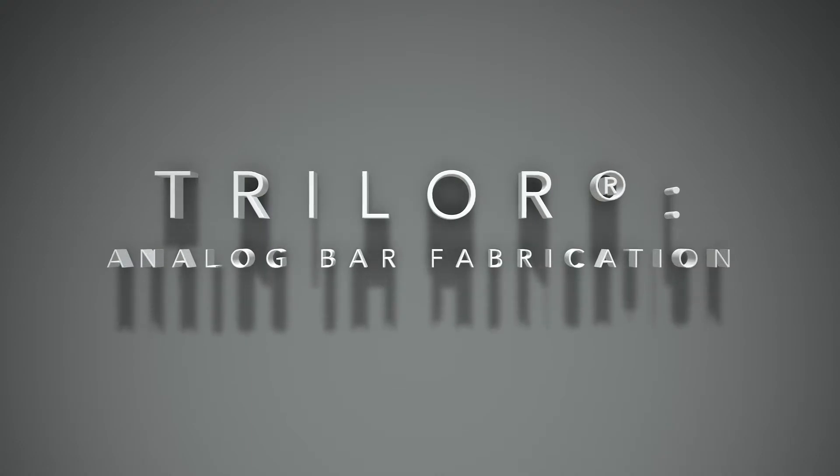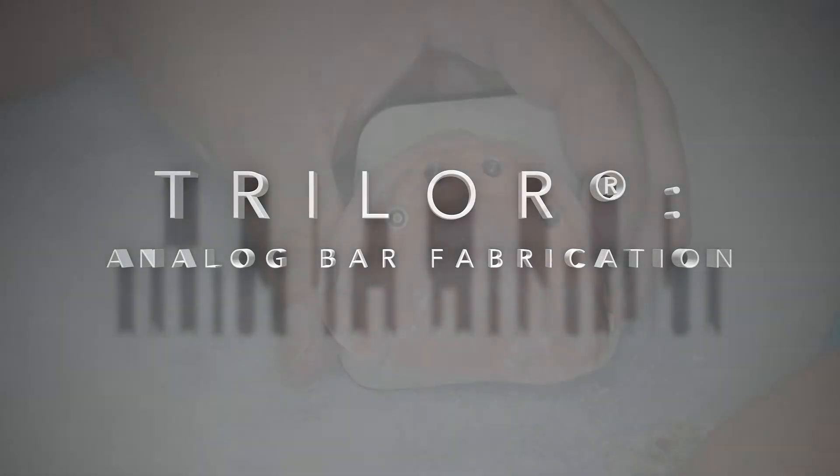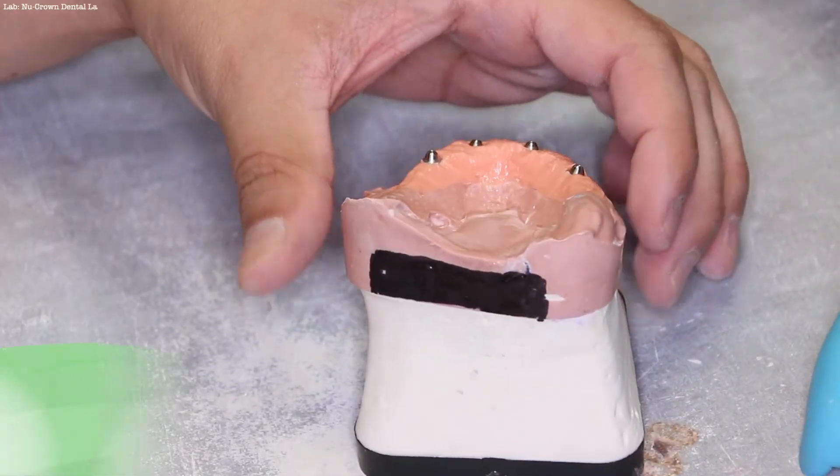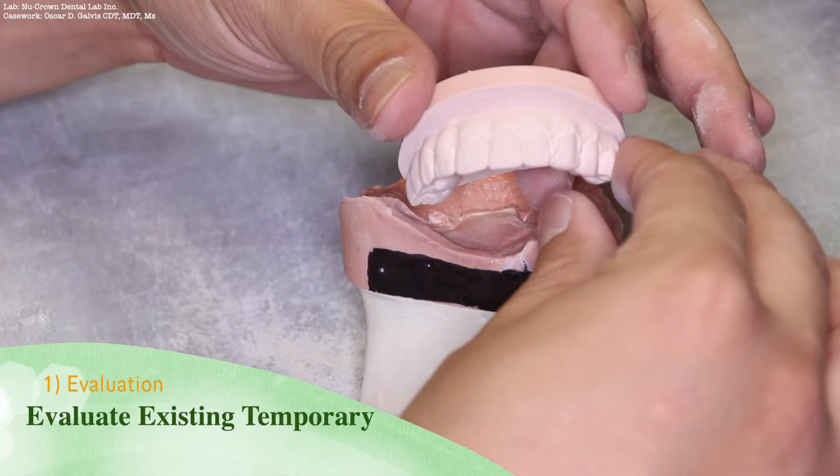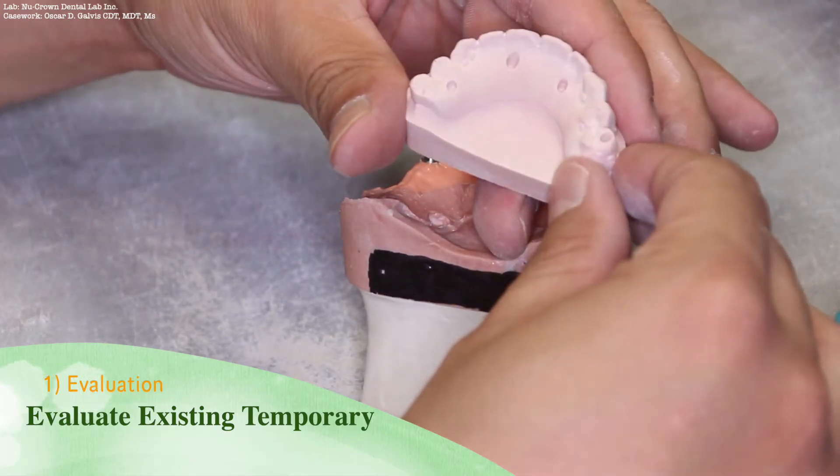Trilor analog bar fabrication procedures. This instructional video will make use of Trilor as a substructure for all on X cases.